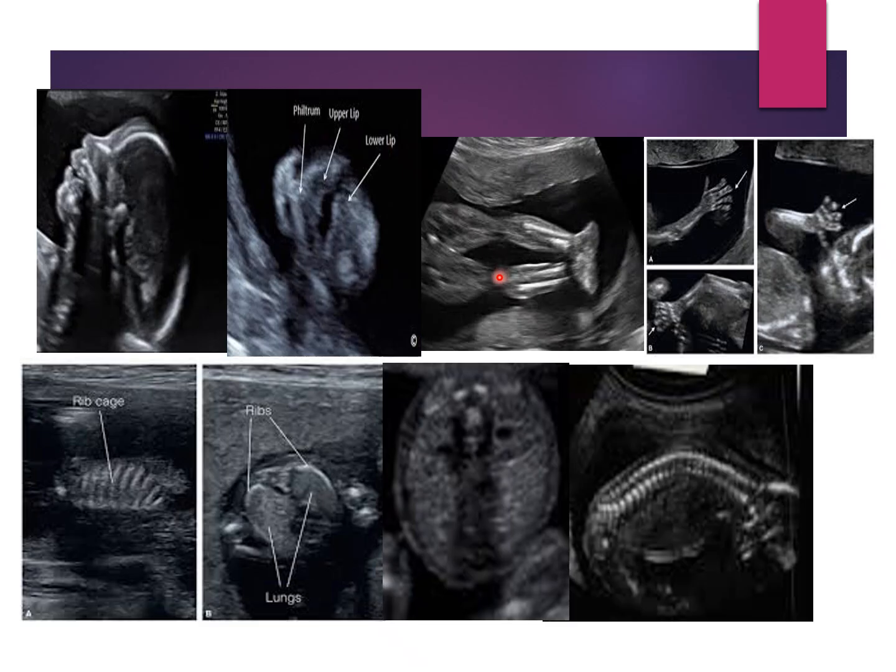And we're going to mark out every limb, including both legs labeled right and left, both arms labeled right and left, and then 5 fingers. We need to make sure that we have 5 fingers on each hand, 5 toes on each foot. You're going to do a side profile of the foot as well to make sure that they don't have any clubbing of their feet.